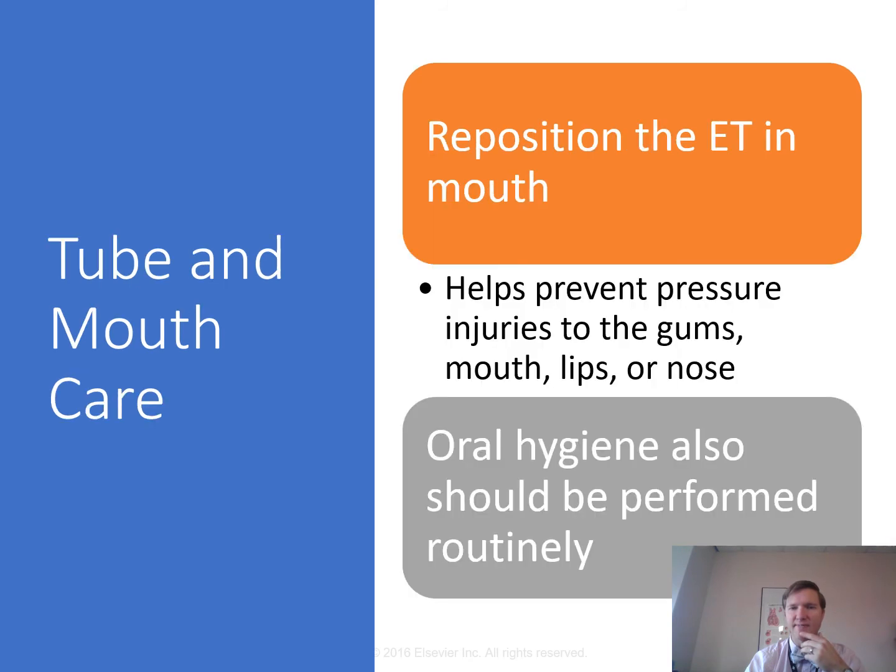All right, what about tube and mouth care? About once a shift, we need to reposition like what we were talking about before. Repositioning helps prevent pressure injuries to the gums, the lips, the nose, so on and so forth.